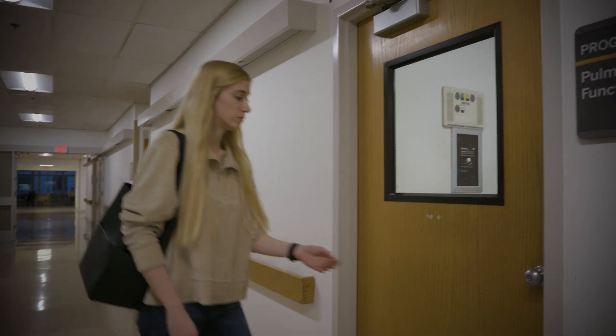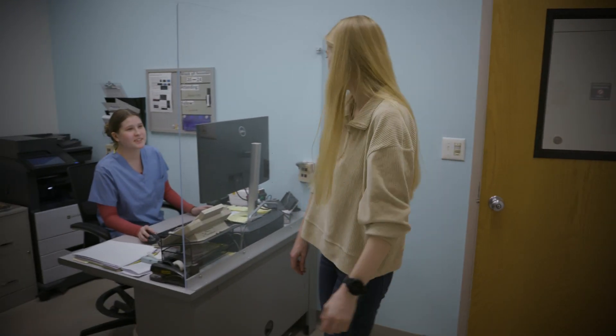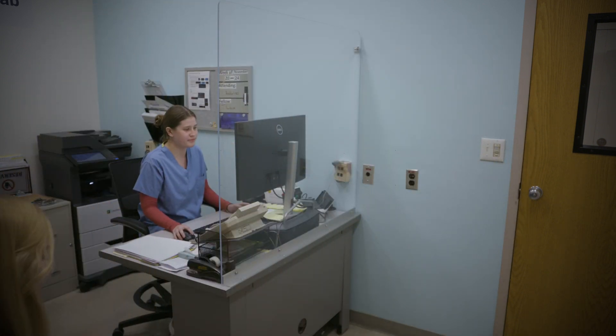Welcome to the pulmonary function lab. Today, you'll be performing a breathing test to measure your lung function. There are several parts to this test, though you may be asked to perform only some of these tests today.